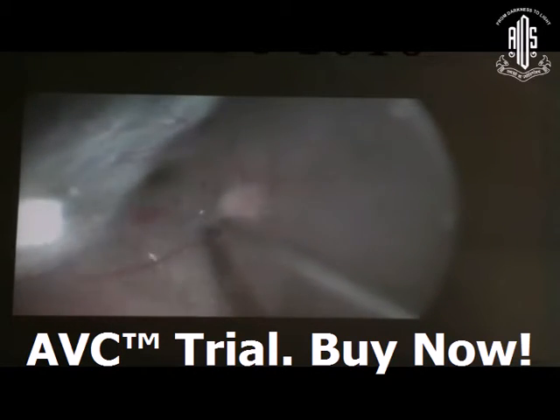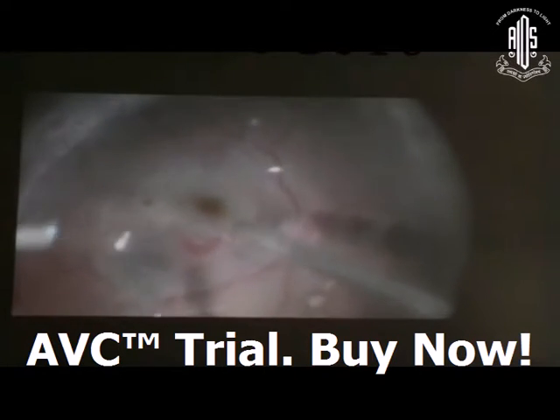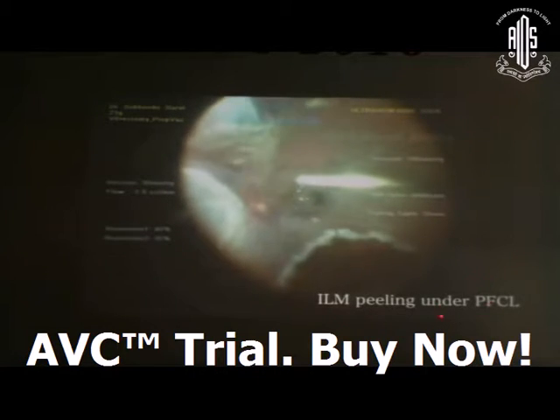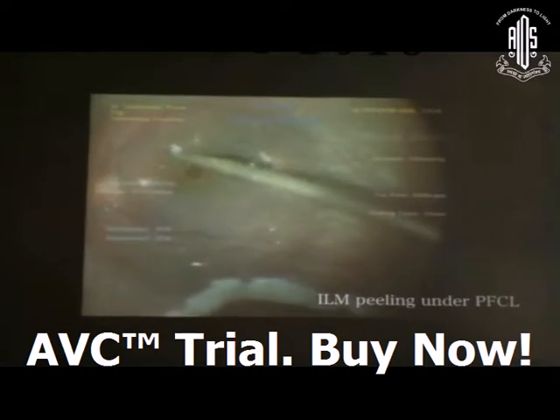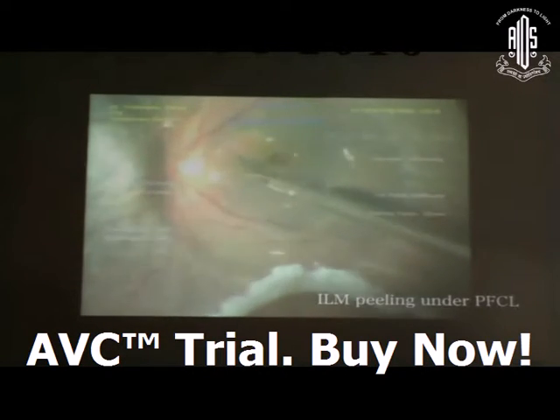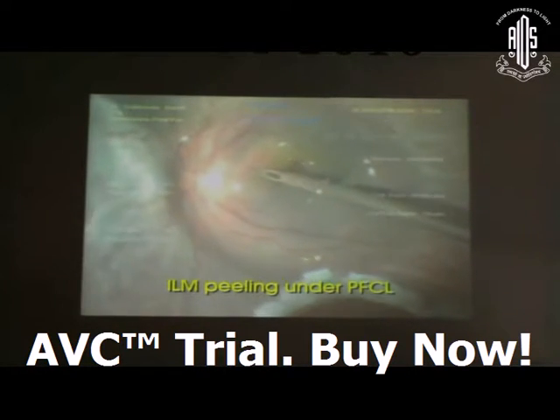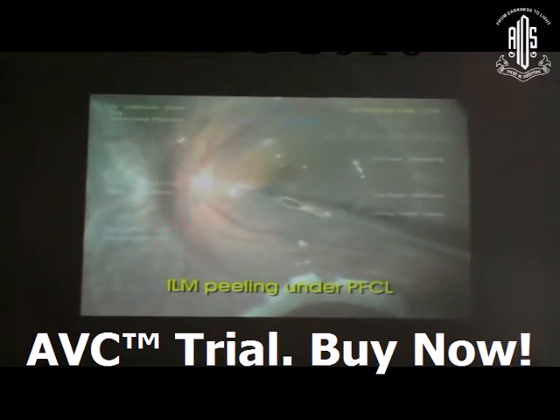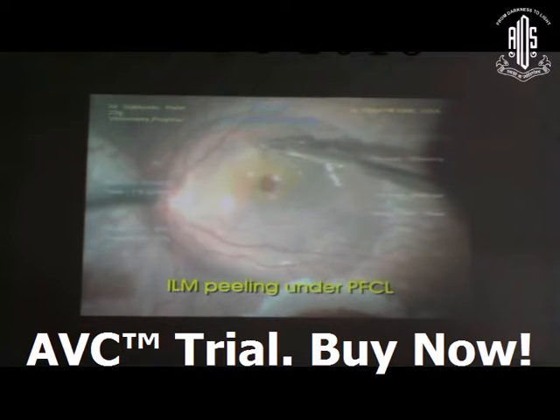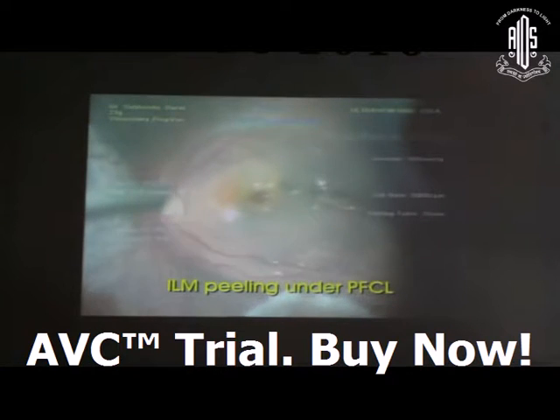You can inject PFCL again to steamroll out the SRF through the peripheral breaks. ILM peeling under PFCL is very safe and can be done in a very controlled manner. Under PFCL, you always get the counter-traction support — the retina will not be mobile. With the grasping forcep, you can do ILM peeling under PFCL very well. This case was associated with a peripheral break, so after that, manage as usual.